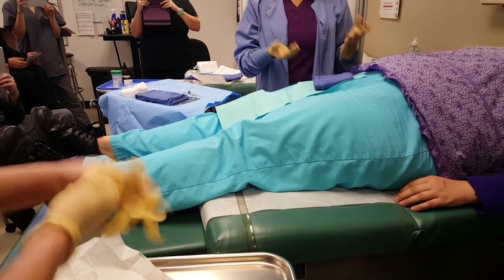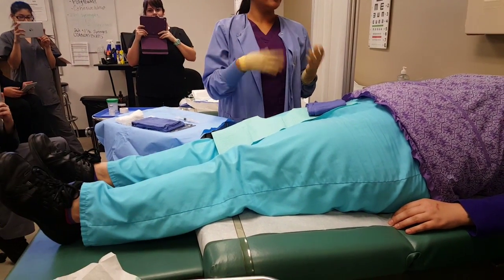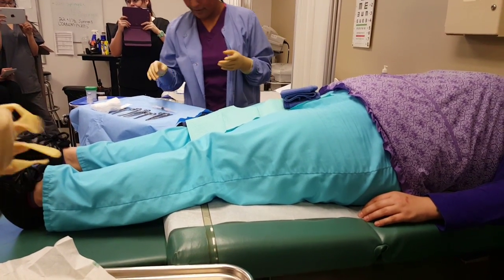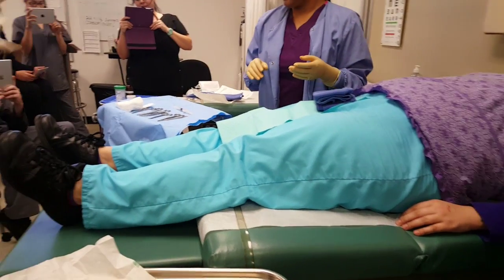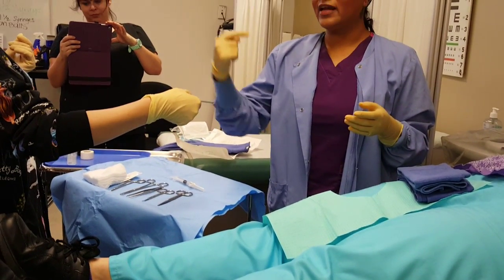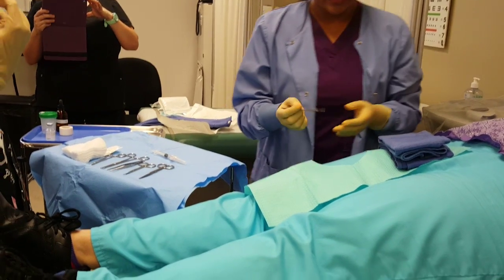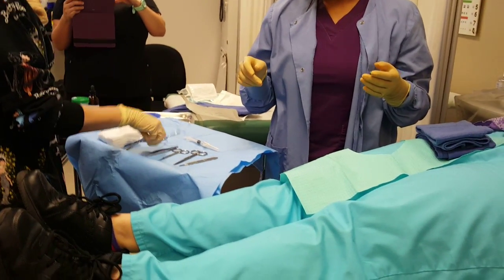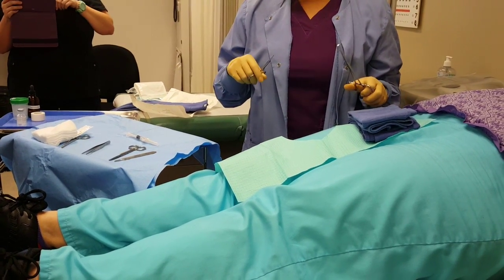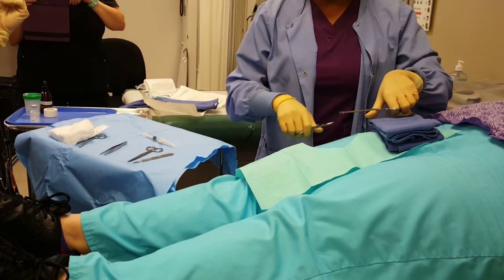You always have to be prepared for the unexpected — we don't know how the patient will react; she could even go into cardiac arrest. That's why a complete patient history is taken first to ensure she's okay for a minor procedure. When handing instruments, the handle must be facing the doctor, and the MA must be cautious of the blade. The MA needs to know her instruments by name — if the doctor says 'allis tissue' and gets something else, that's a problem.